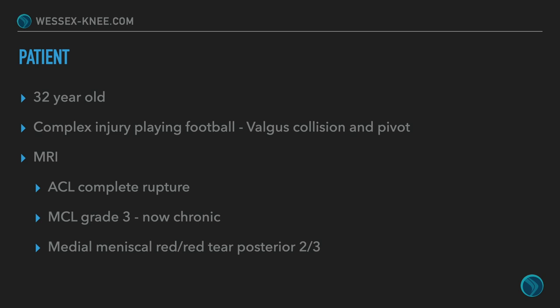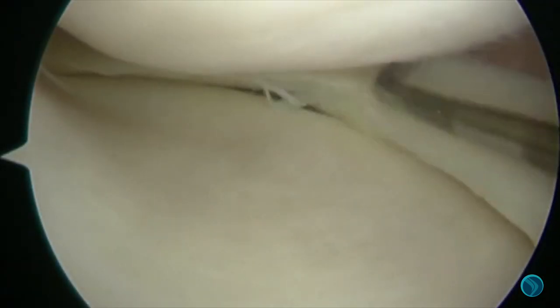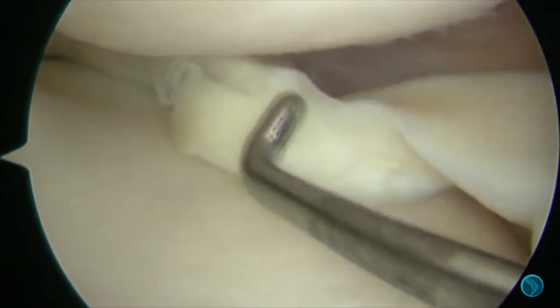When we got in to do an arthroscopy and examine his knee, there was gross opening of the medial joint compartment, Lachmann's positive with a gross pivot shift. Once we were in the knee, as you can see, the meniscus is very unstable. We used a shaver just to freshen things up to allow some bleeding edge and for it to heal.